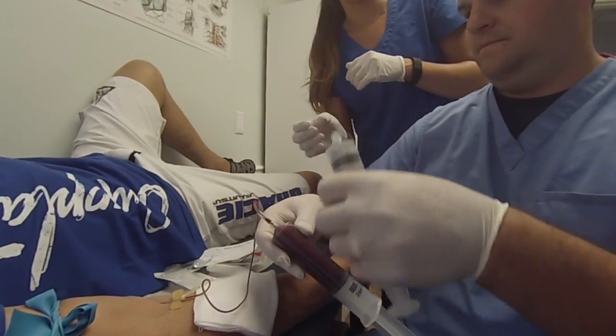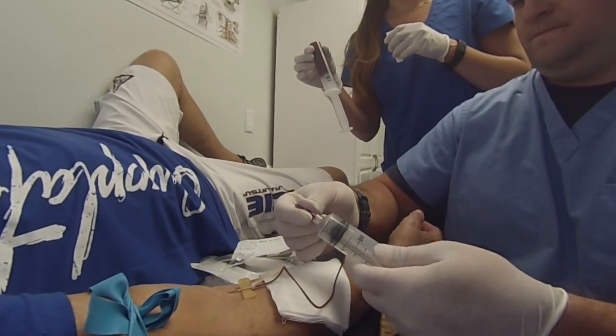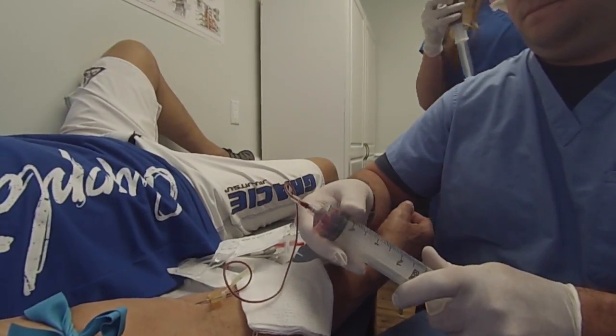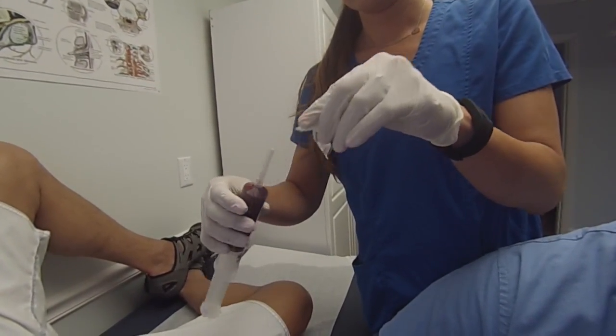Pinch the extension line on the butterfly to prevent blood flow and carefully disconnect the syringe containing 45 mLs of anticoagulated blood, and pass it off to a second operator. The second operator will connect a blunt plastic cannula to the syringe and gently invert to adequately mix the whole blood and anticoagulant.